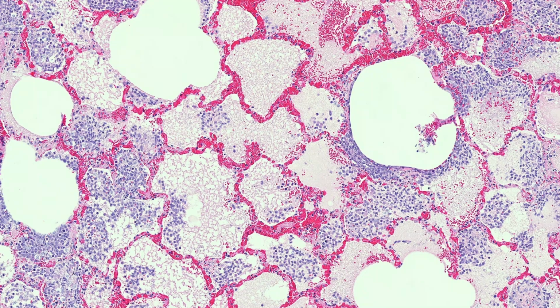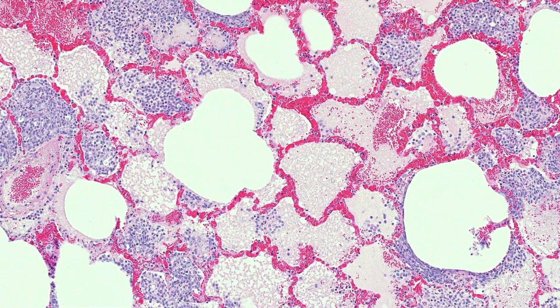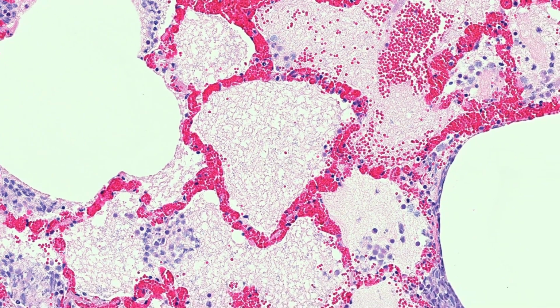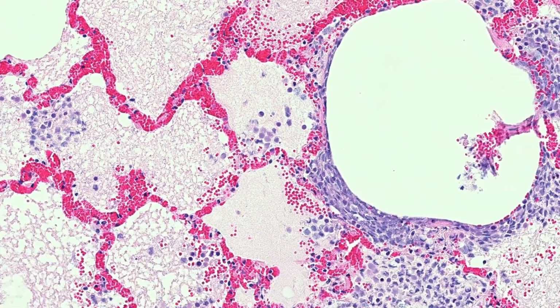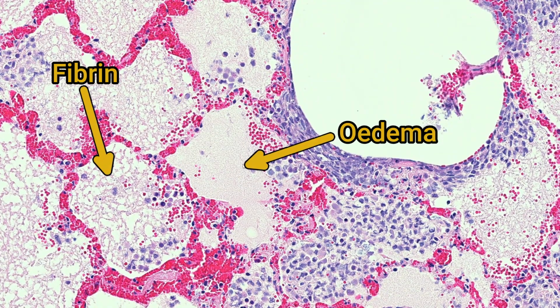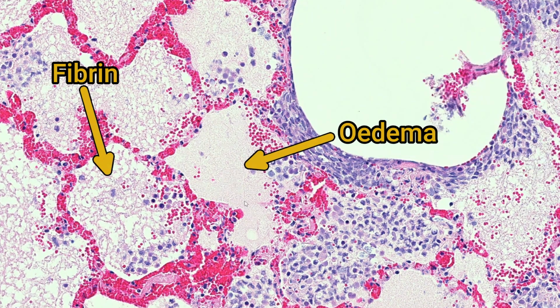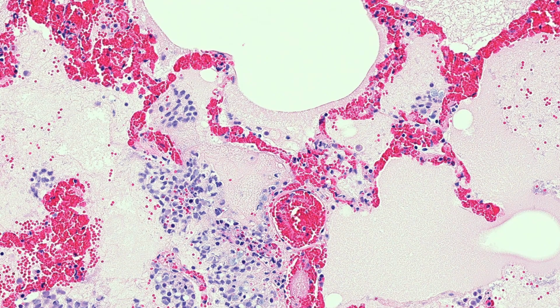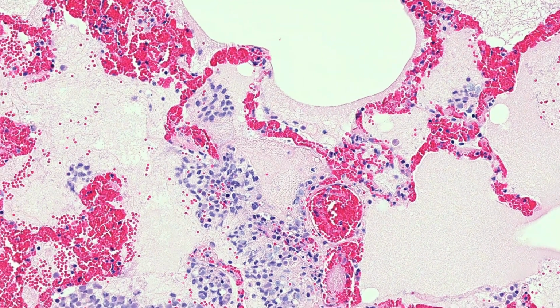These bacteria incite a reaction that produces an unbelievable amount of fibrin, and it looks like pink string or a messy meshwork of pink eosinophilic material. So you can see this alveolus here is filled with this meshwork of pink fibers. That's all fibrin. You can contrast it maybe to this slightly stippled eosinophilic material, which is maybe more edema. Certainly over here, I'd say that this is more edema fluid. And then this stuff here, this meshwork of pink fibers, is all fibrin.